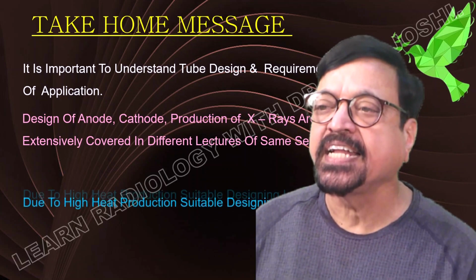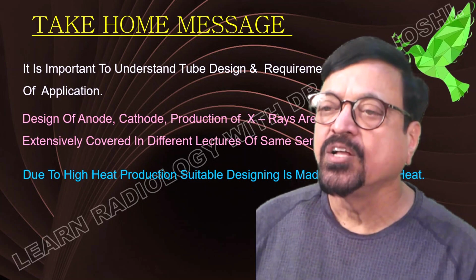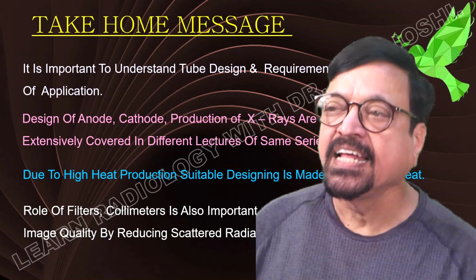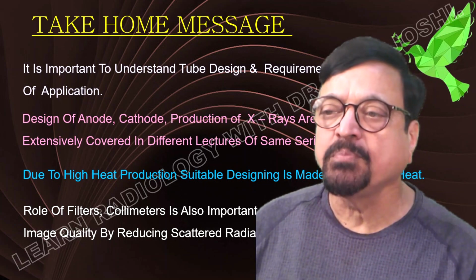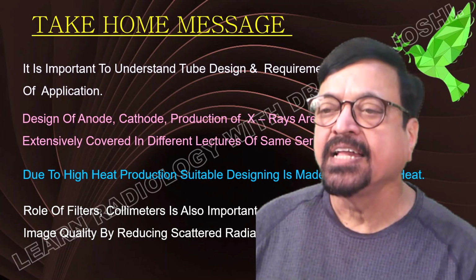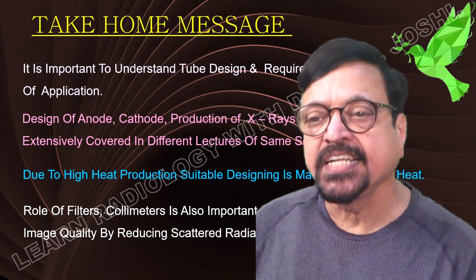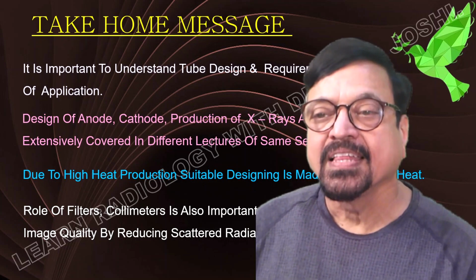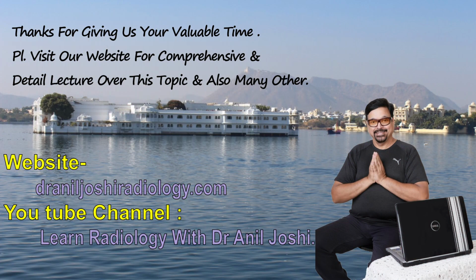Due to high heat production, suitable designing is made to dissipate the heat, as we have seen in the lecture till now. Now, the role of filter and collimator is also important for improving image quality. Not only by putting in a high capacity tube can you achieve the results, but you will have to have proper filters, collimators, etc., so that you can get a good image.